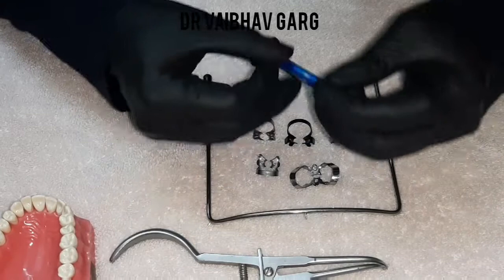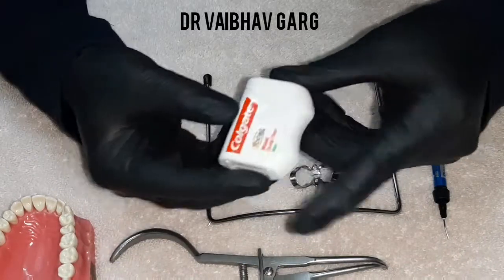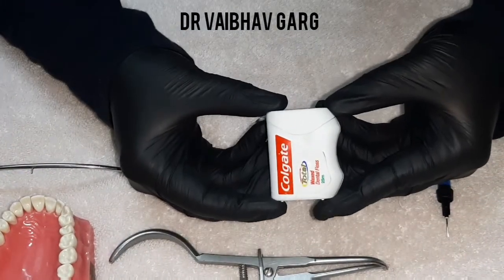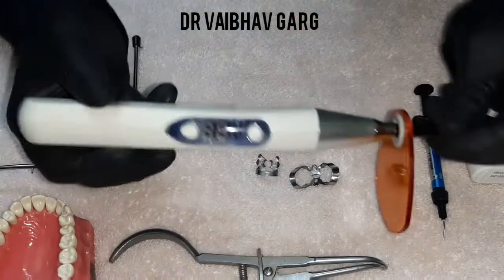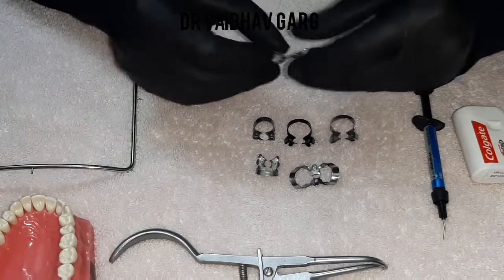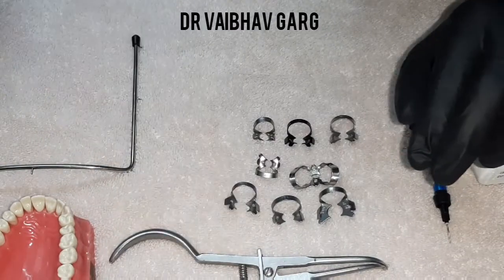We will be using liquid dam also — I will teach you how to use it. Floss is very essential. You might also need a light curing unit, and these simple clamps will be helpful.